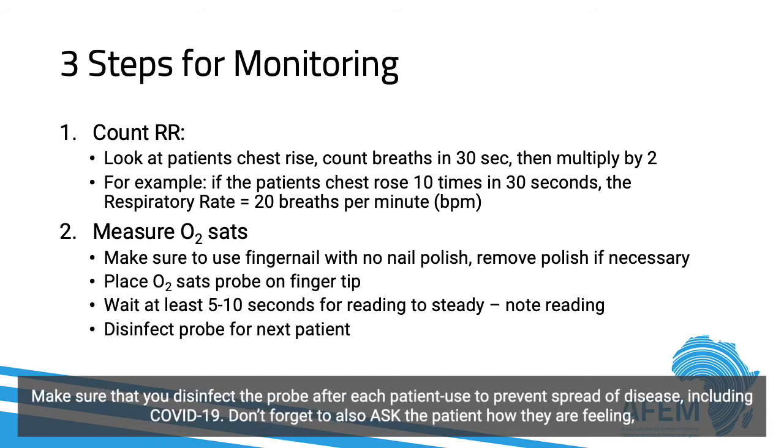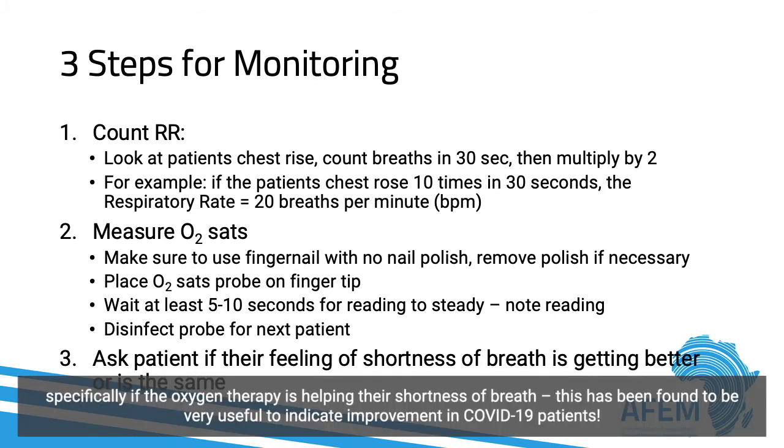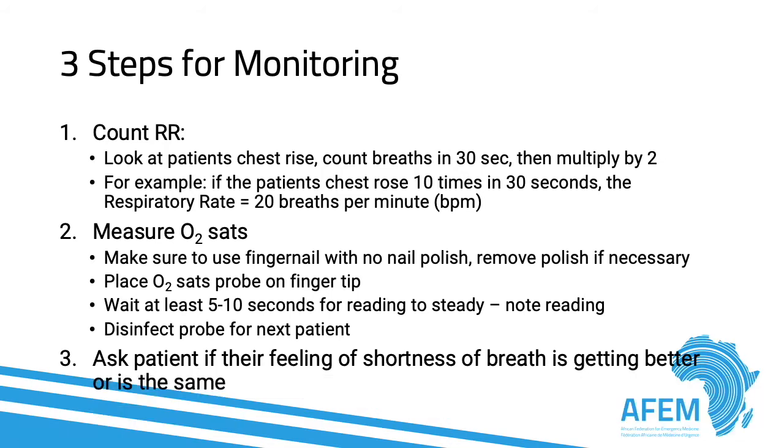Make sure that you disinfect the probe after each patient use to prevent the spread of disease, including the spread of COVID-19. Don't forget to also ask the patient how they are feeling, specifically if the oxygen therapy is helping their shortness of breath. This has been found to be very useful to indicate improvement in COVID-19 patients.